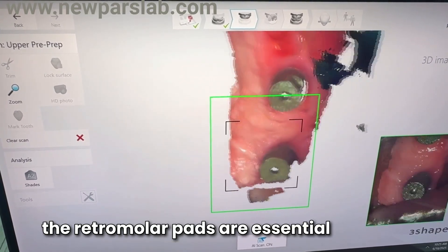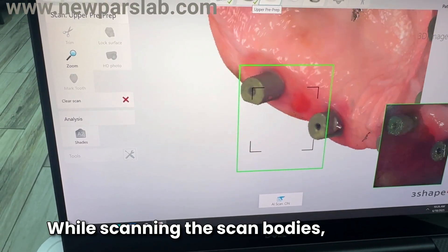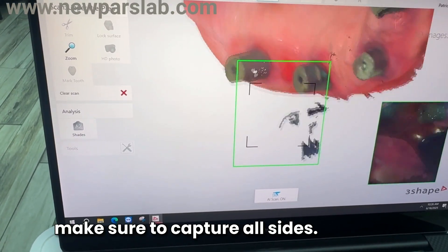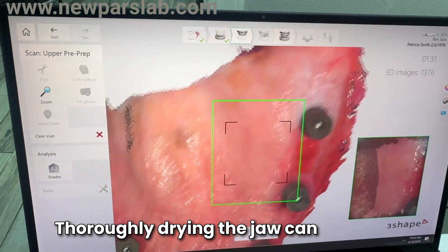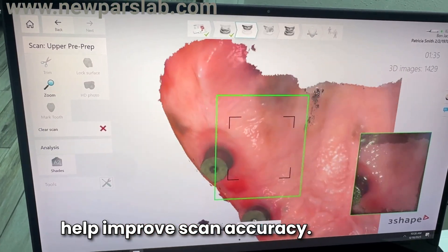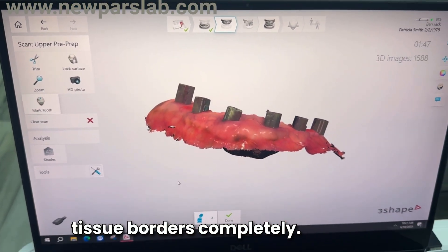For the lower jaw, the retromolar pads are essential landmarks for this technique. While scanning the scan bodies, make sure to capture all sides thoroughly. Drying the jaw can help improve scan accuracy. Also, be sure to scan the soft tissue borders completely.